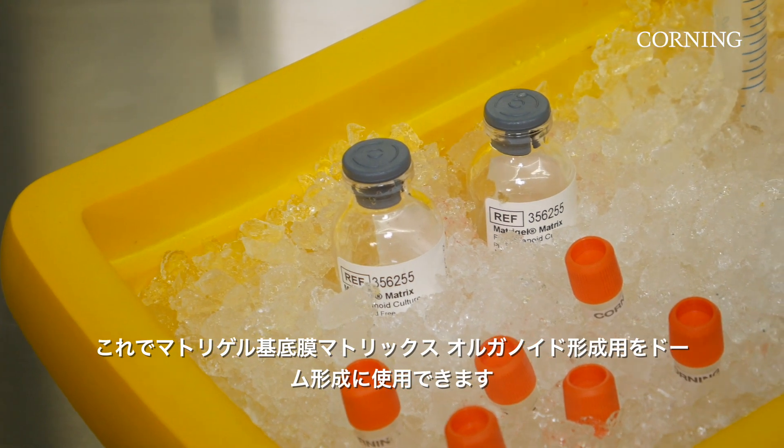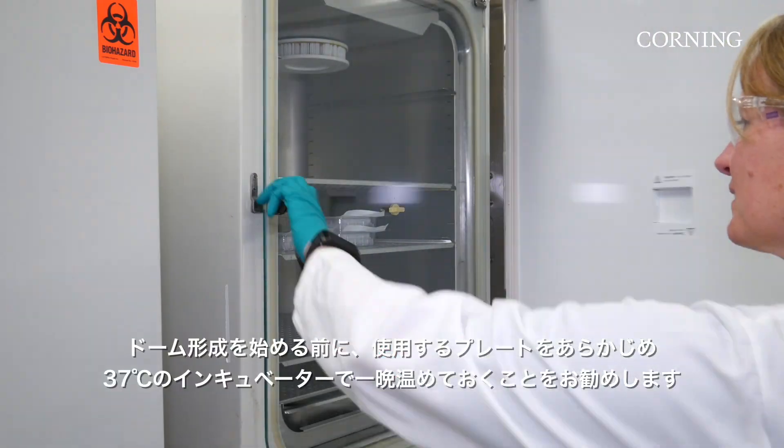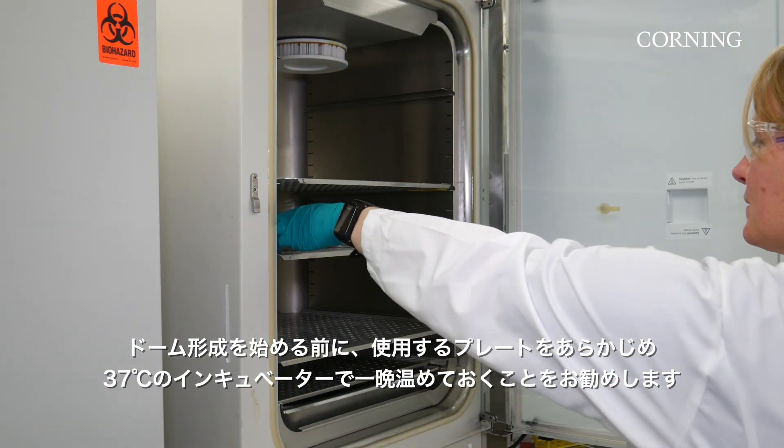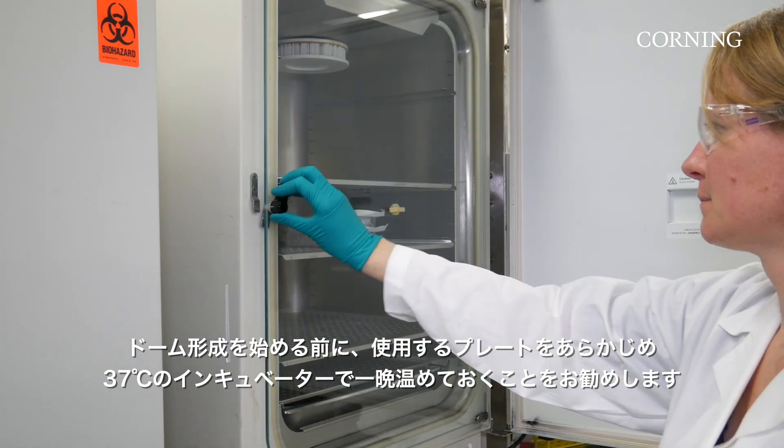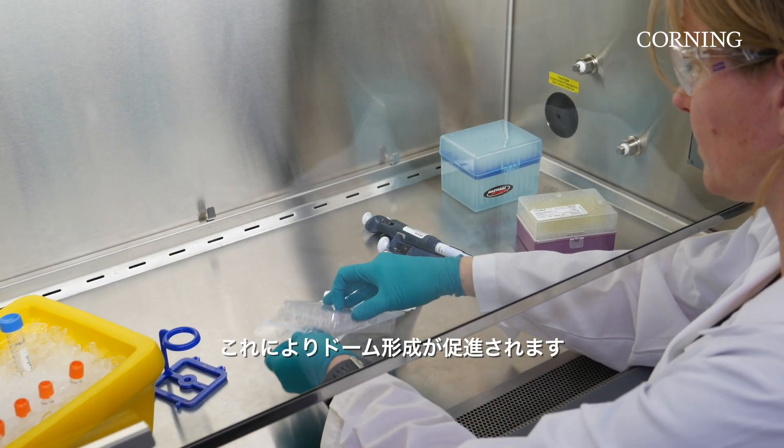Matrigel Matrix for organoid culture can now be used to create domes. Before plating your domes, pre-incubating cell culture plates at 37 degrees Celsius overnight is recommended. This step encourages better dome formation.